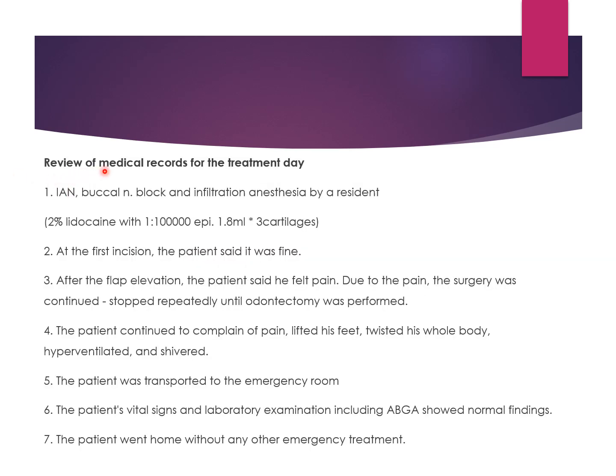Let's review the medical records for the treatment day. First, IAN block and infiltration anesthesia by the resident. Second, at the first incision, the patient said it was fine. Third, after the flap elevation, the patient said he felt pain.